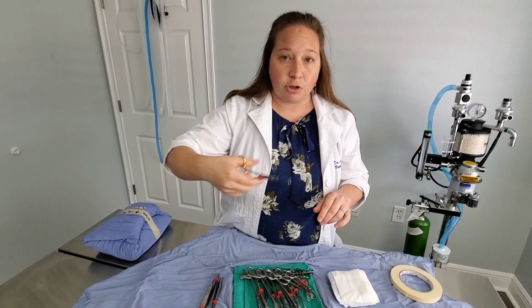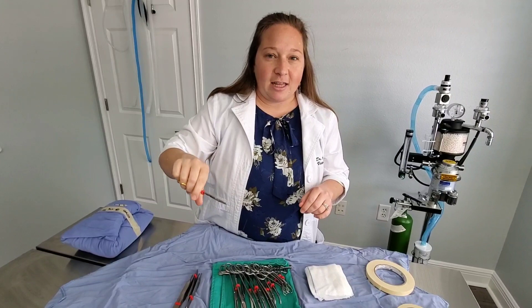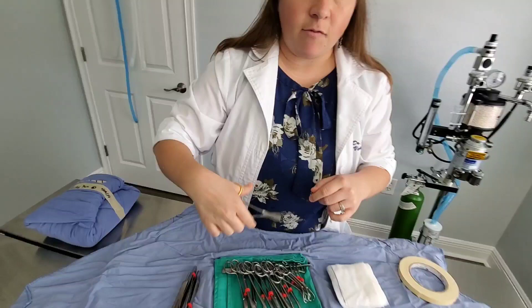This is our needle driver. The needle driver holds our suture — we grab the suture needle with it and clamp down. If you hear that click, that's the clamping sound. We clamp down on the needle to do the suturing we need. It's also very cool because it has a cutting device right here that will cut my suture when I'm done, so I can do everything more efficiently.